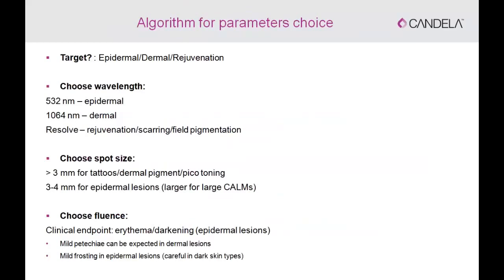Mild frosting is expected in some cases of epidermal pigmentation, but try not to get much frosting in darker skin types, as that can subsequently lead to post-inflammatory hyperpigmentation.